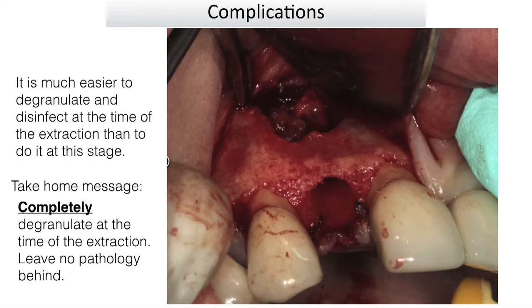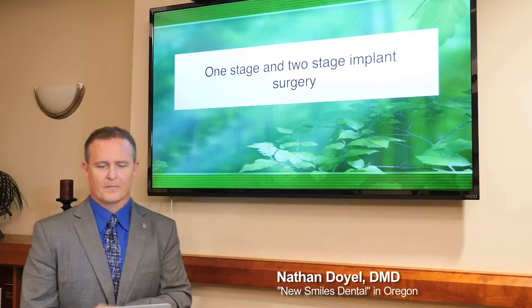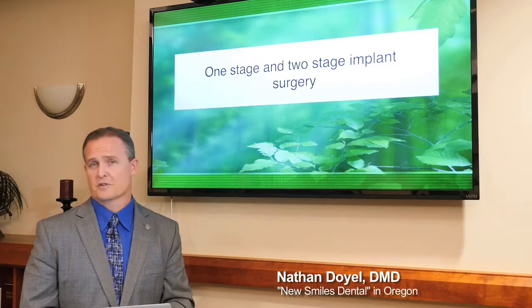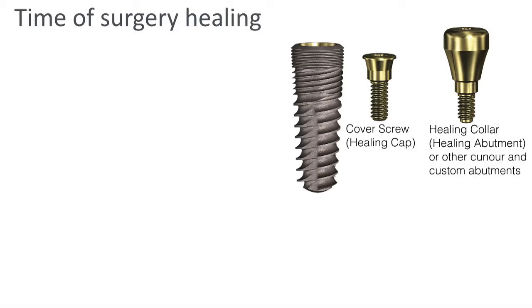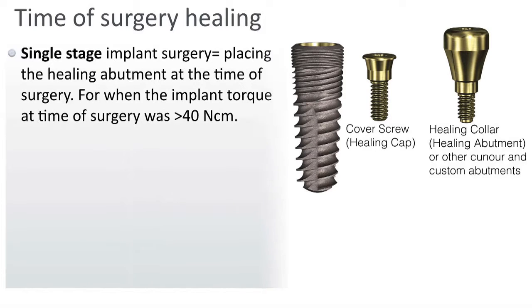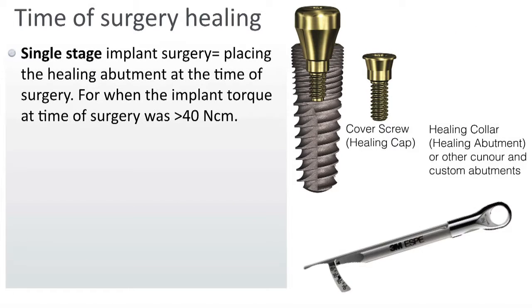All right. You've probably heard of one stage versus two stage implant surgery. What does it mean? Let's talk about that real quick. It's the time of surgery, the healing that's going to be taking place. So a single stage is placing the healing abutment at the time of the surgery.